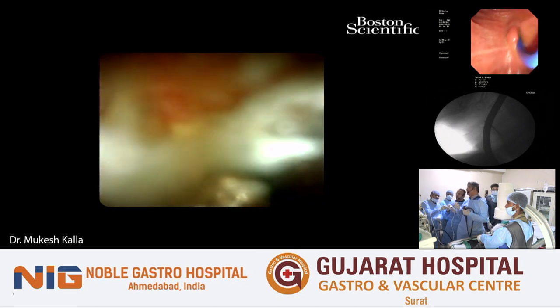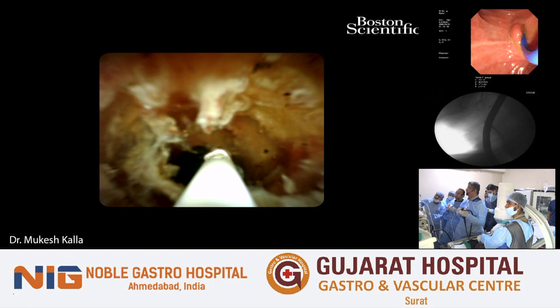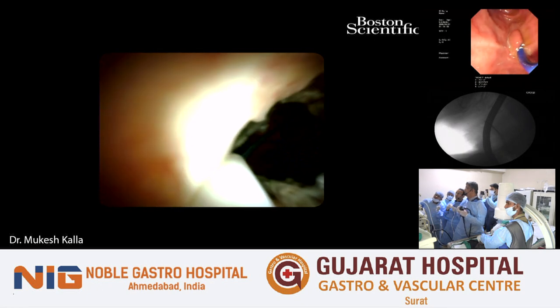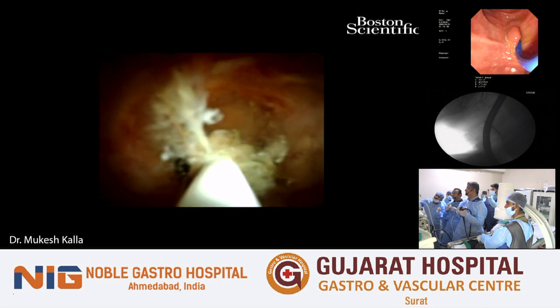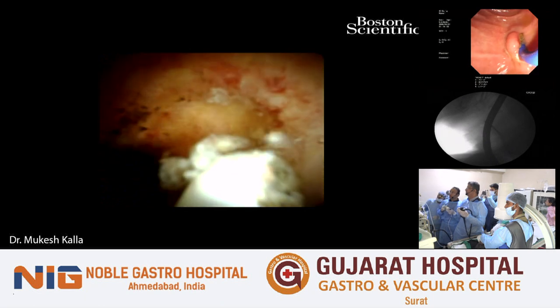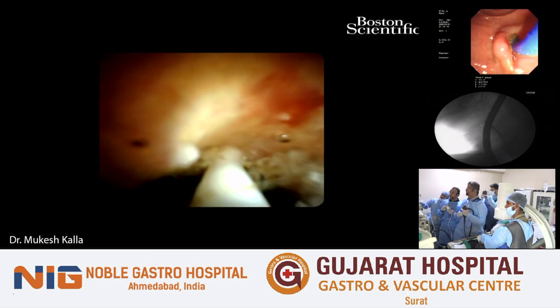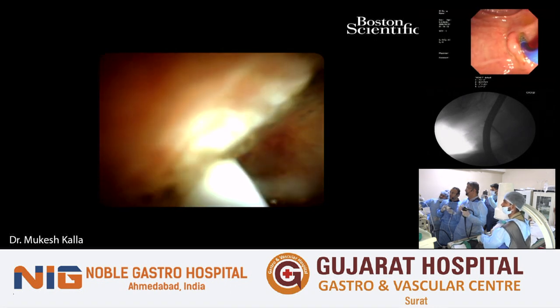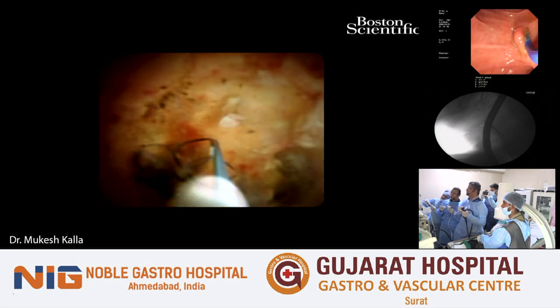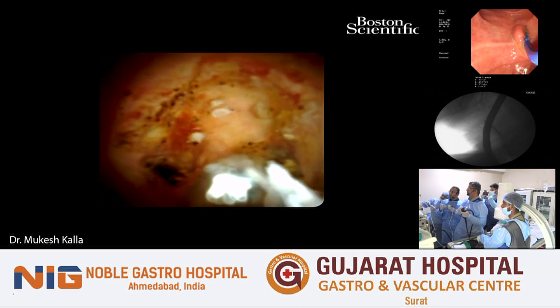It's all in your hand now. Open. Open the basket. Sir, a little irrigation. So Somil is doing this case for us. He will hold. Close. Let's see. Flush. Irrigation. Close. Sir, we have to go deeper. Yes. Open now. There. Close. We go inside, sir. Yes.